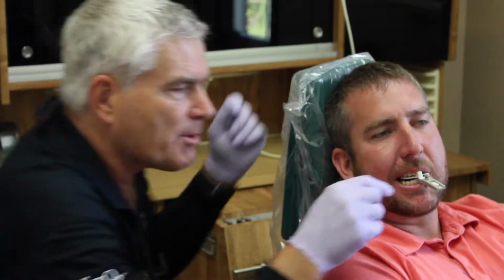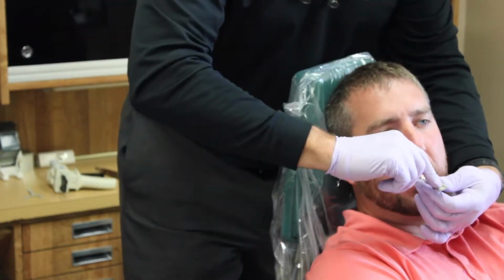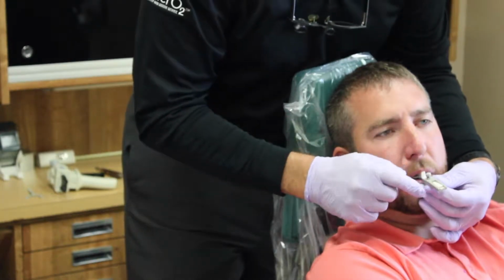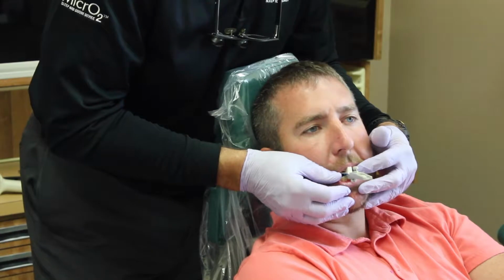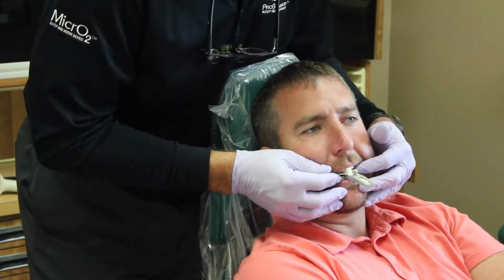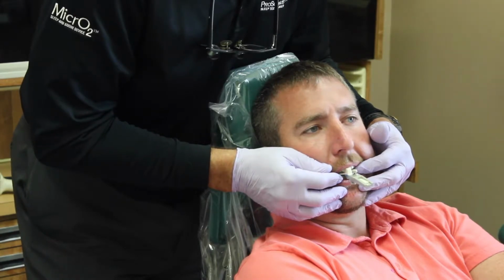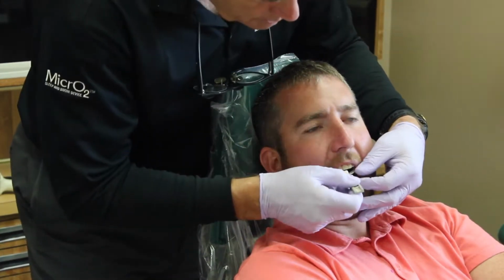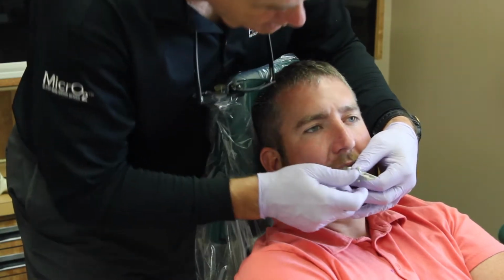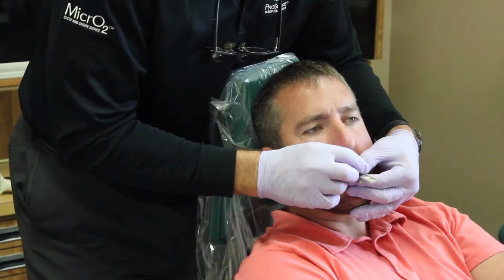And now I'm going to stand up above him, and I'm going to have Jeff go through his range of motion, forward and back. And there's a millimeter rule right here in the front. Thank you. Come back. Okay. Jeff, slide forward and back, and forward and back. And one more time. Okay. Let me do that one more. Slip that back on there. Okay. Forward and back. Excellent.